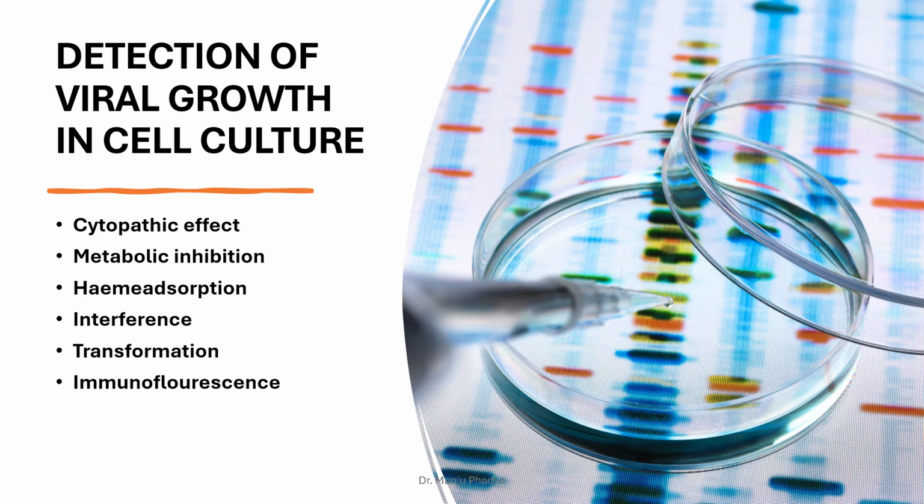In normal cell cultures, the medium will turn acidic due to the cellular metabolism. However, when viruses are grown in cell cultures, the cell metabolism gets inhibited and there is no acid production.